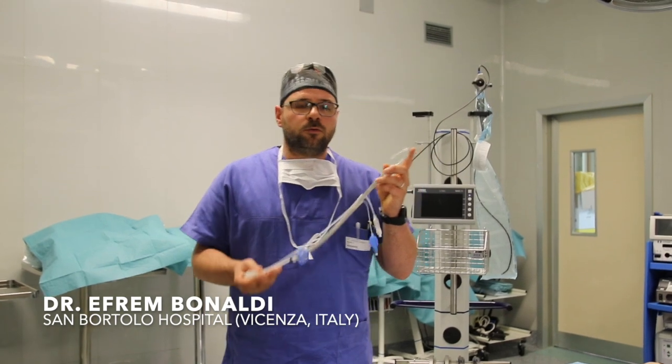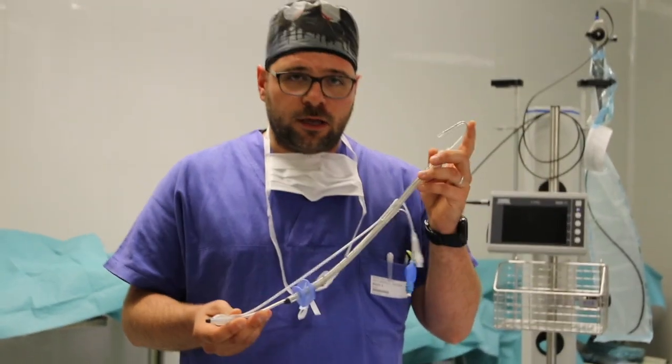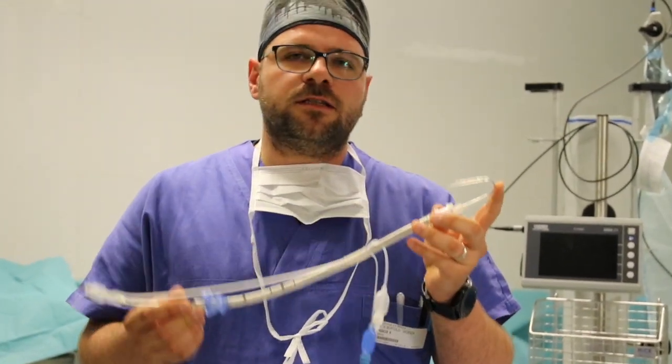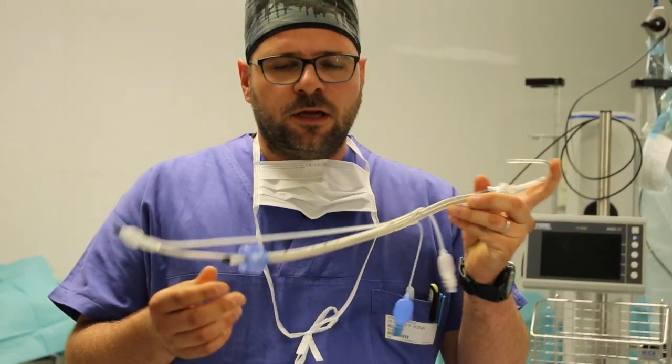Hello! Let me introduce SpritzTube, a brand new airway management device that is capable of both supraglottic and infraglottic ventilation. As you can see, it's a reinforced tube made of medical grade silicone that can be resterilized up to 30 times at 134 degrees.